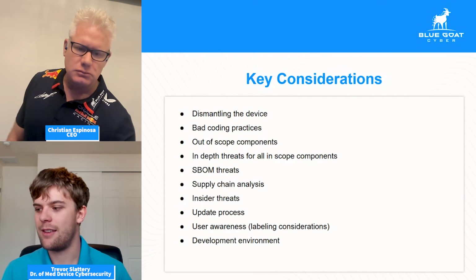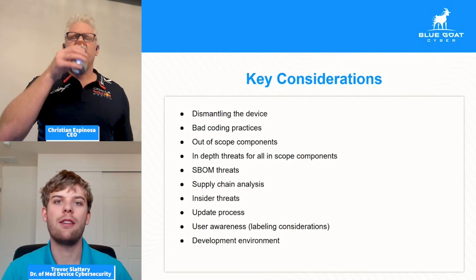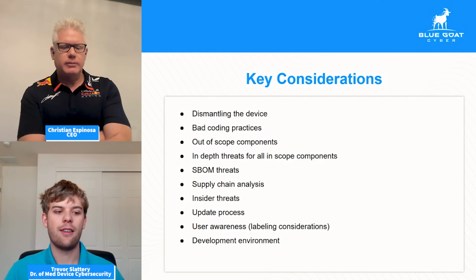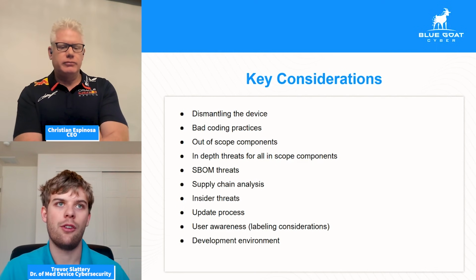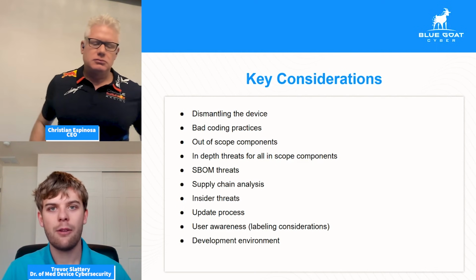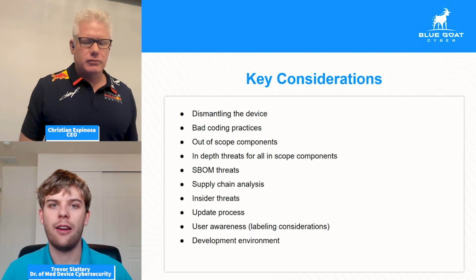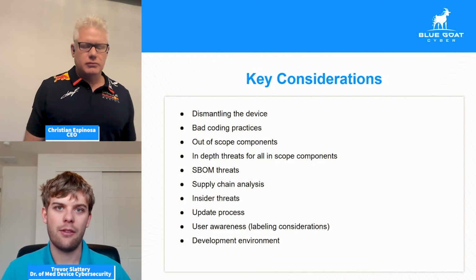Now, the update process is a hot topic with medical devices right now. The FDA wants to see devices that are capable of being updated over the air or through remote service or on-site service. This is very important since if a vulnerability is identified after the fact, you're able to make sure that you can replace the firmware or the software with something more secure, and that vulnerability is designed out of the system. Now, while of course this is great to have that update functionality and the ability to make changes to the system, it needs to be considered from a security perspective as well.